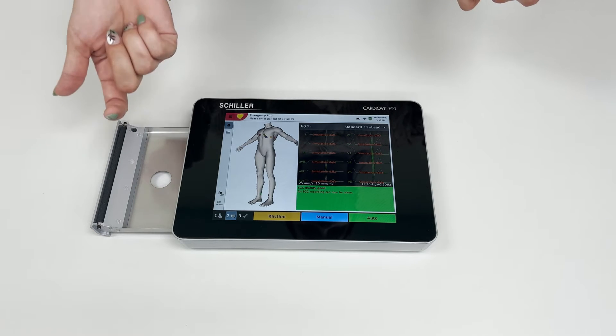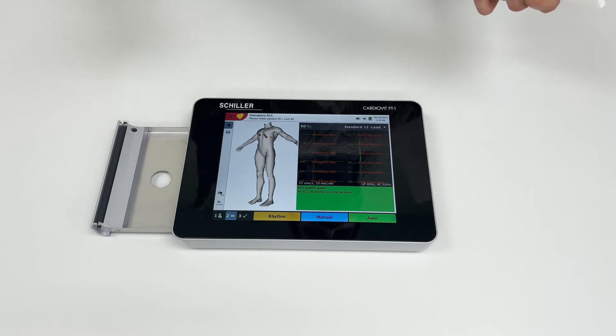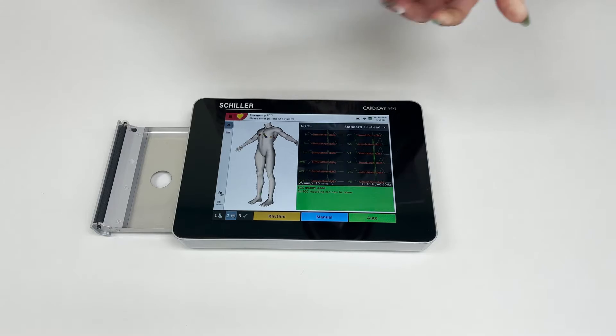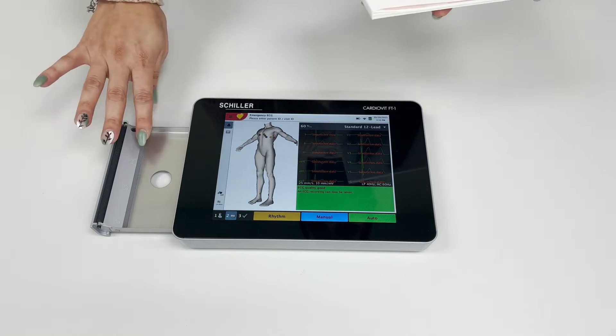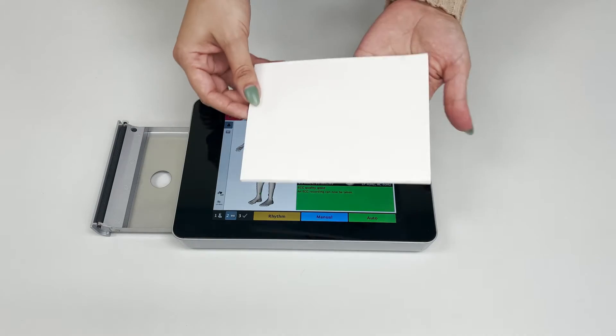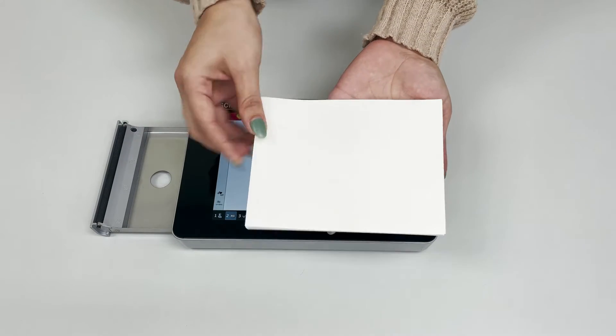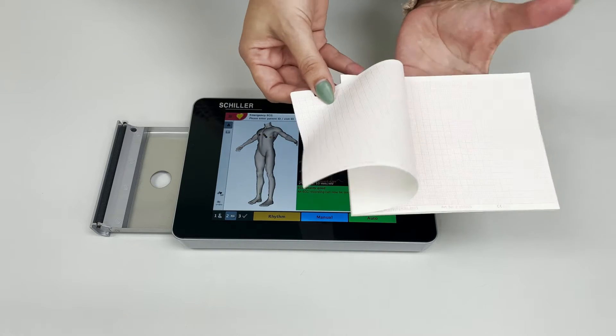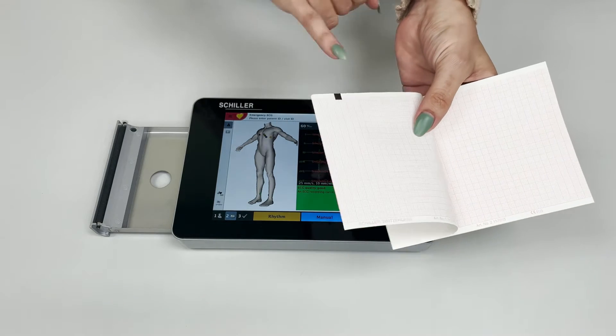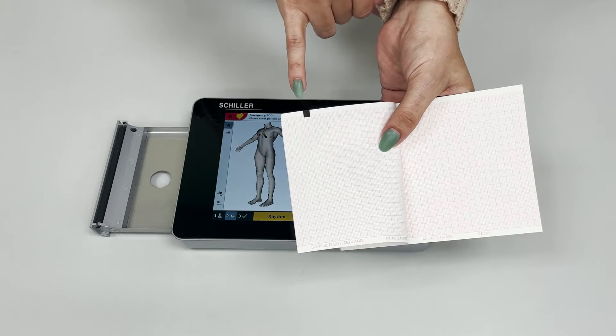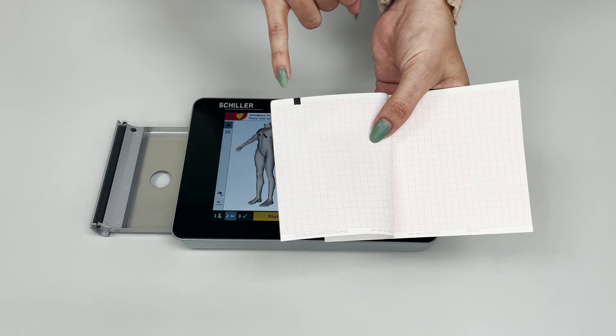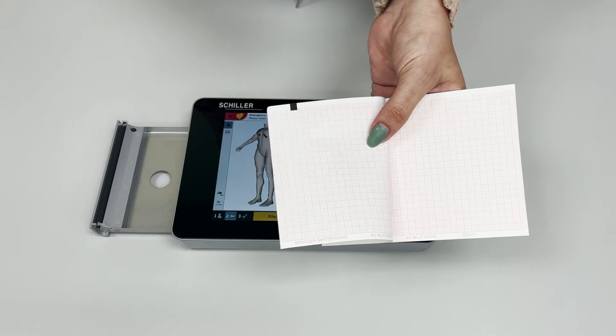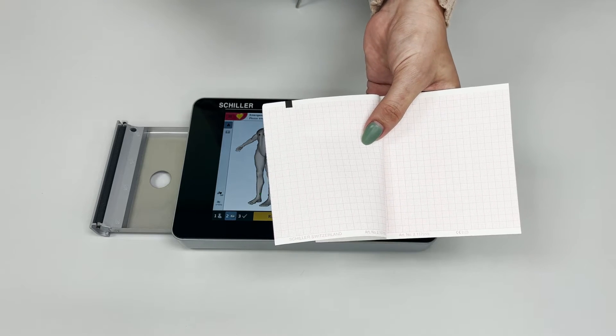Once the paper drawer is open, you'll take your stack of paper. If you notice, there is a black registration mark on the corner of the paper itself. This black registration mark must always be placed in the top left corner.